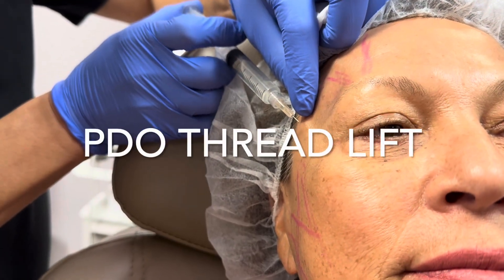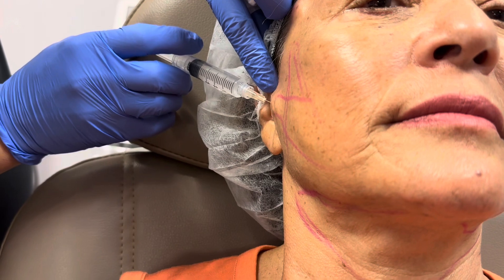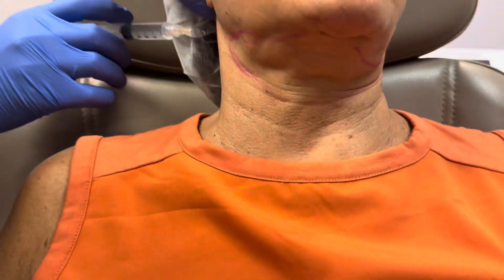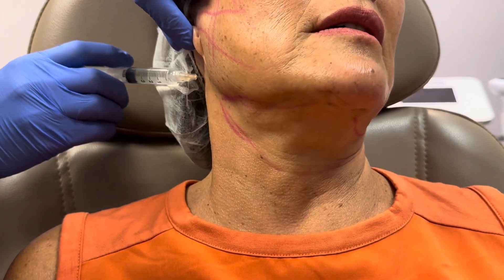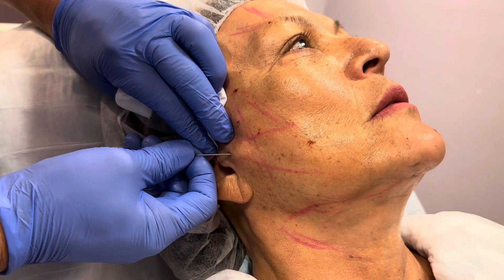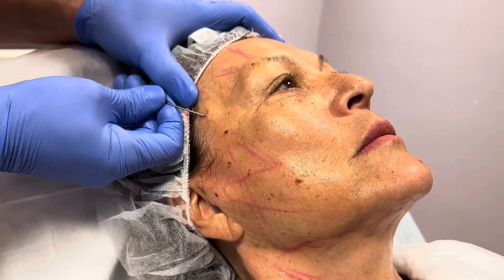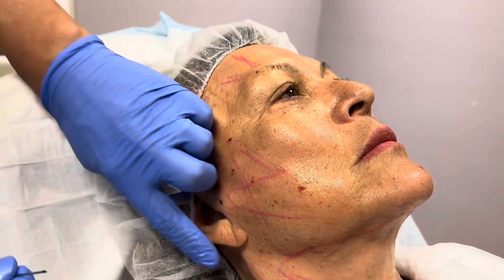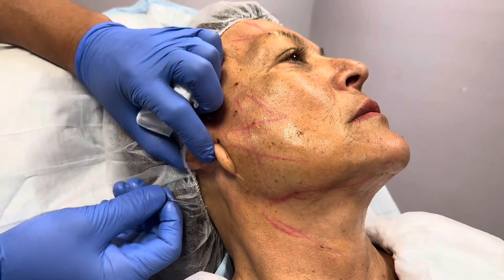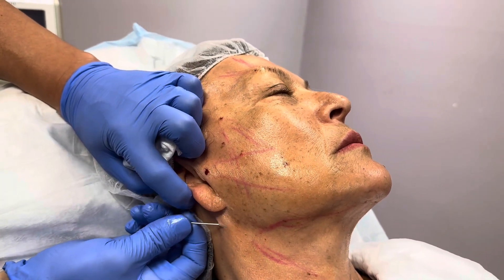Here we are numbing our entry sites with lidocaine. This will numb the skin so that we can make a little hole with a bigger needle through which we will insert our cannula. And this is the pilot hole we're making — this is the bigger needle, and we're just making the holes where we are going to go in with our blunt needle that has the thread on it.